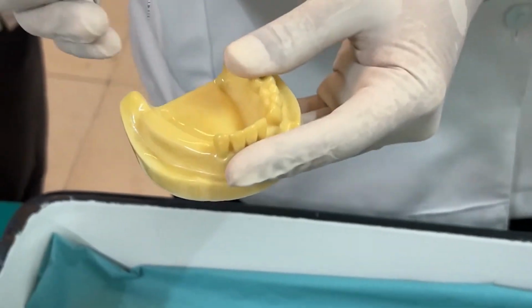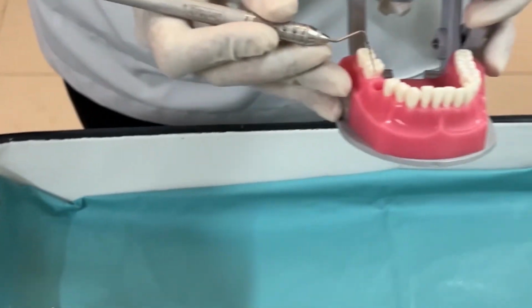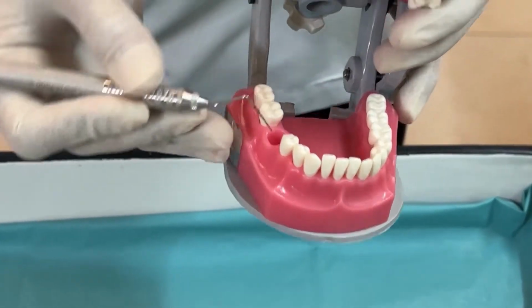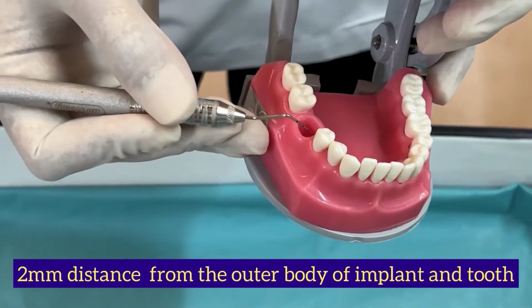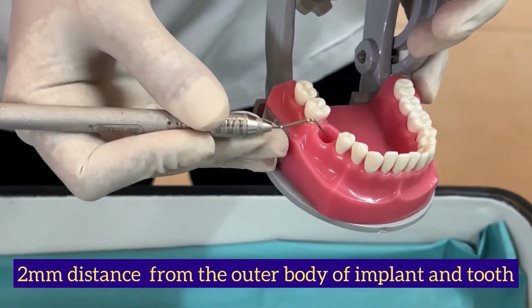The next is 2. We say rule of 1, 2, 3. 2 basically means that ideally after placement of the implant in the center, roughly 2 millimeter distance should be there between the outer border of the implant and the adjacent tooth.